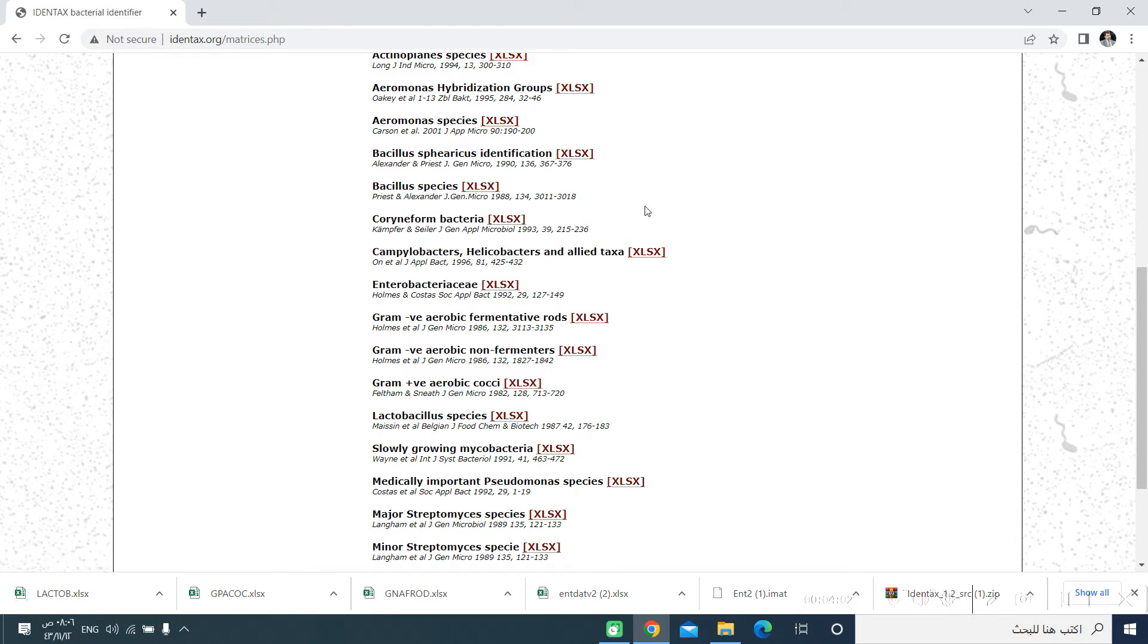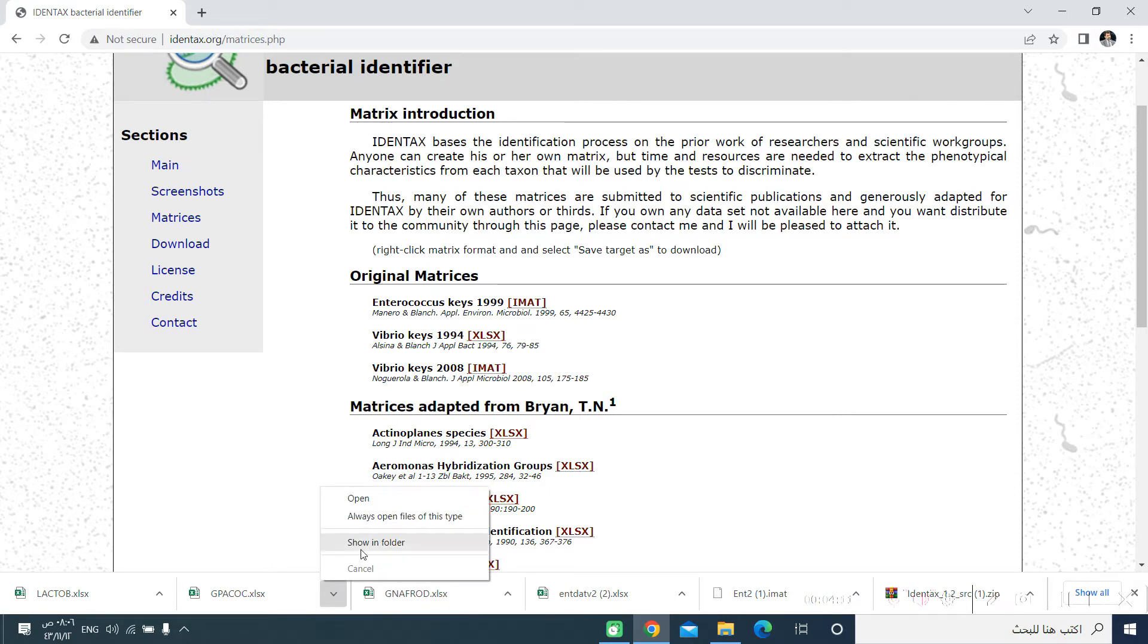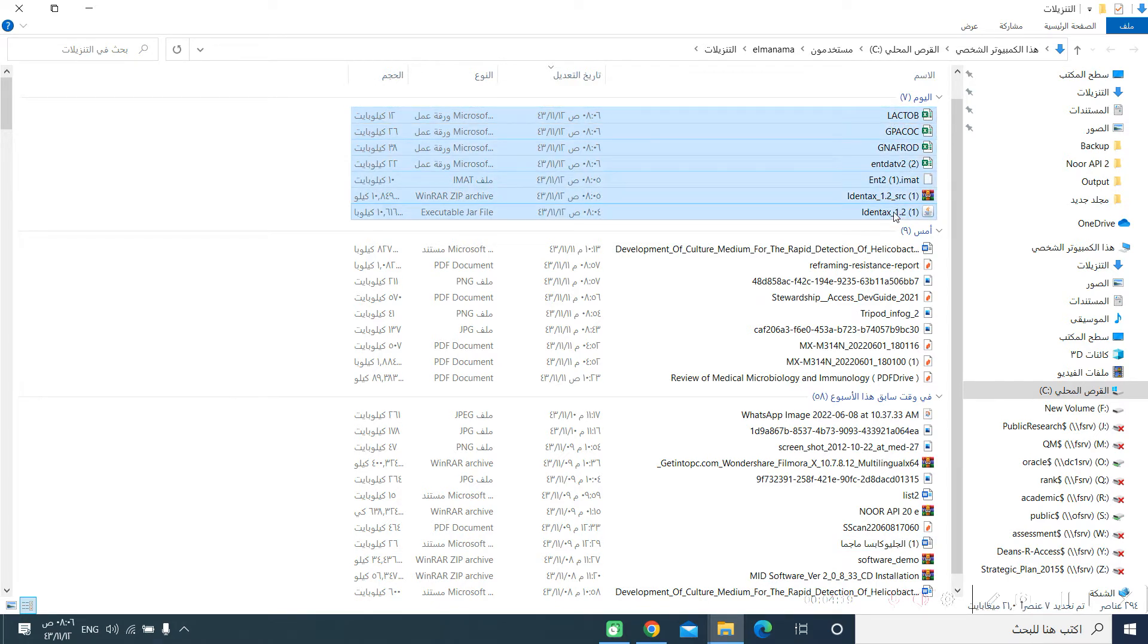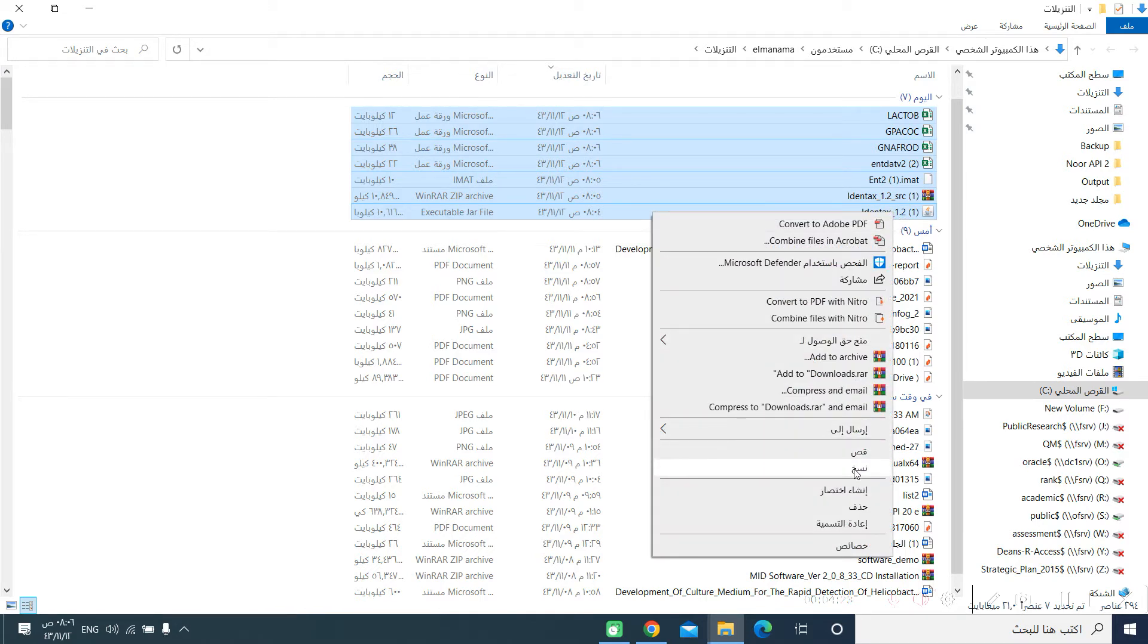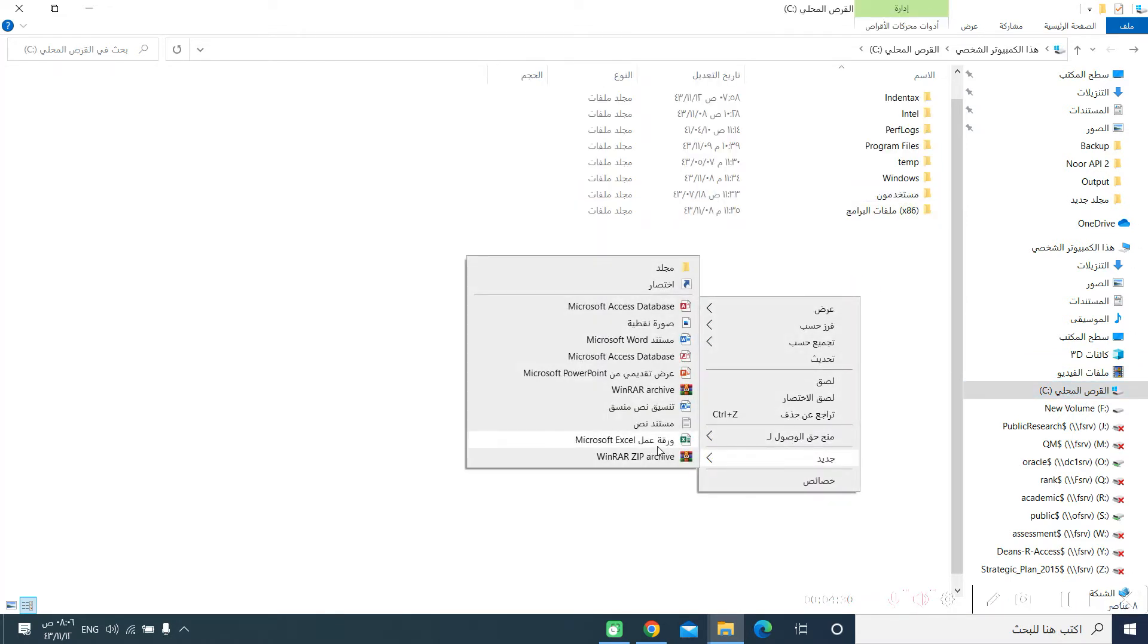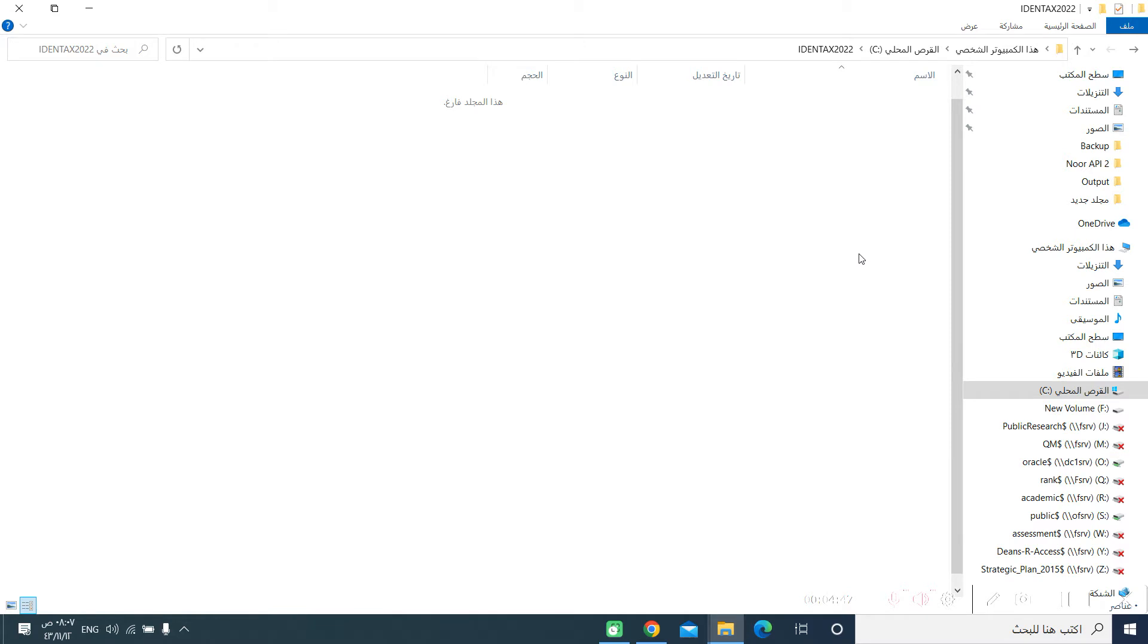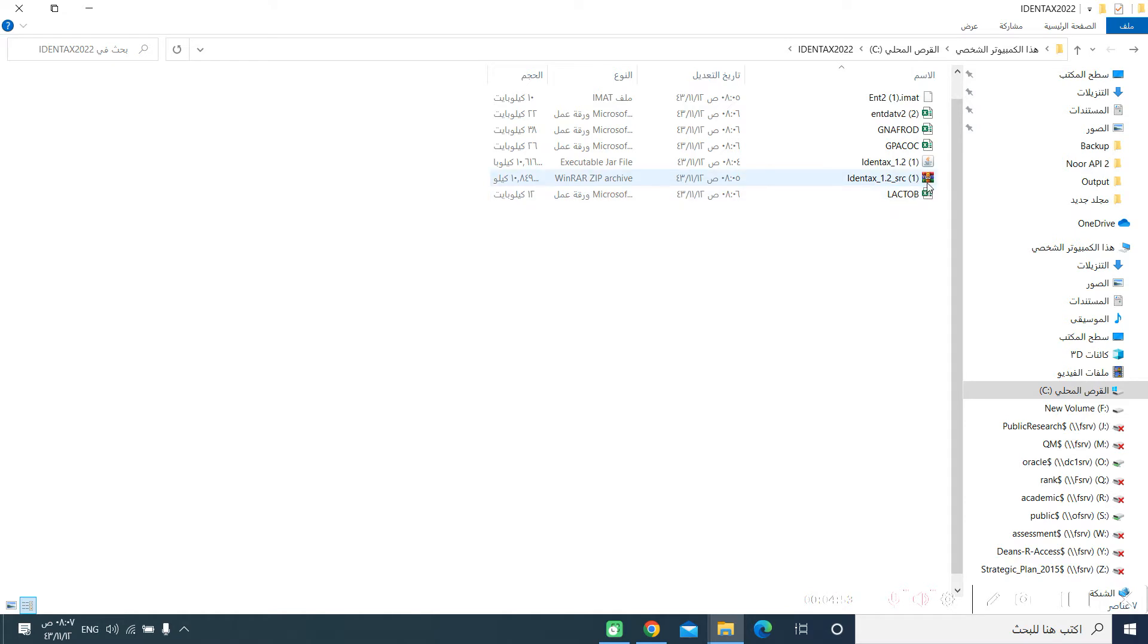Okay, we have downloaded a lot of these matrices. We can now go to the folder that we downloaded these files. We will select all the files that we have downloaded. We will copy them or we can also make a new folder. Let's name it IDENTEX 2022. Then you paste all of your files that you have downloaded. One of them is the IDENTEX 1.2 SRC. This file is a zipped file. You can extract it here.